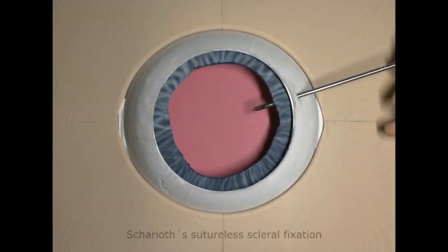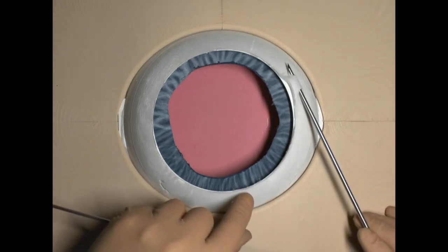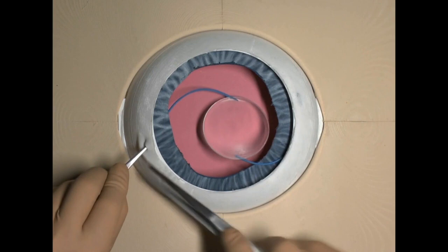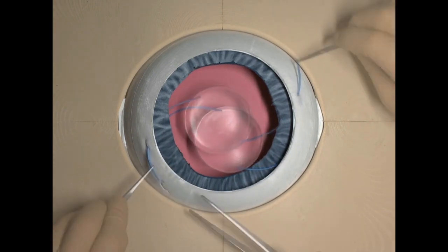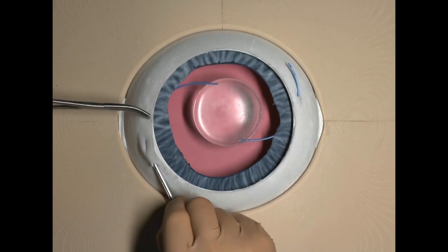Scharioth begins his sutureless fixation by a straight sclerotomy using 24-gauge needle. From the external part is created a limbus parallel tunnel 2-3 mm long. The haptic of 3-piece lens is externalized using 25-gauge forceps and pulled through the tunnel.